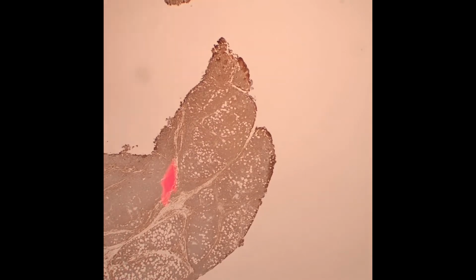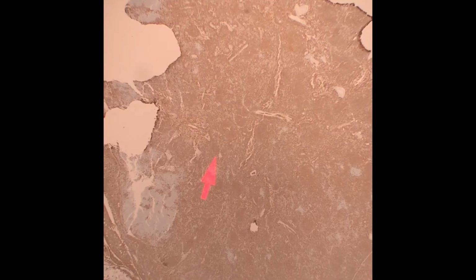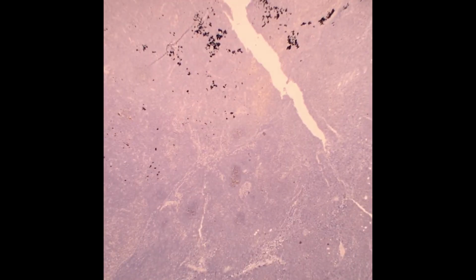This is a CD20. Again, the cells infiltrating the fat are CD20 positive B cells, as we would expect from the flow cytometry. And we see that there doesn't appear to be co-expression of CD43 on our CD20 positive cells. This is a BCL6, and it very nicely shows a few preserved follicle centers, but the vast majority of the cells are going to be negative.